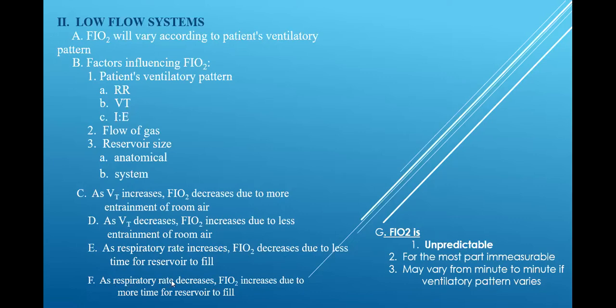And as my respiratory rate decreases, then my FiO2 will increase due to more time for reservoir fill. So think of it like this. Think if you were hungry, you hadn't eaten in 2 days, and I gave you a morsel, like a breadcrumb, one breadcrumb at a time, would you ever get full? Would you ever even know you were eating? You won't even feel like you're eating, right? Because it's just nothing, right?